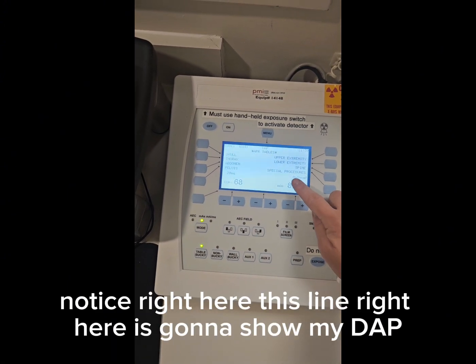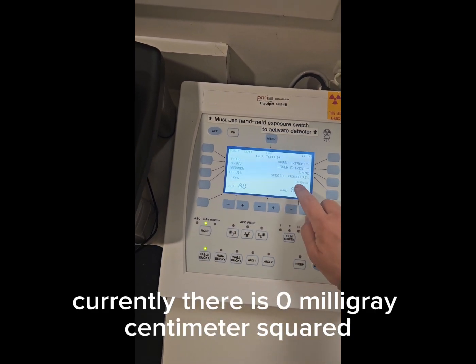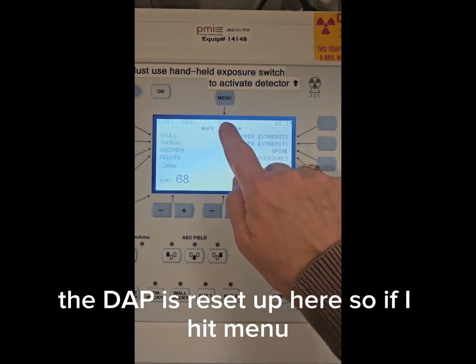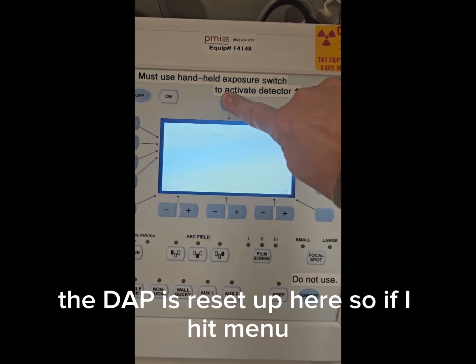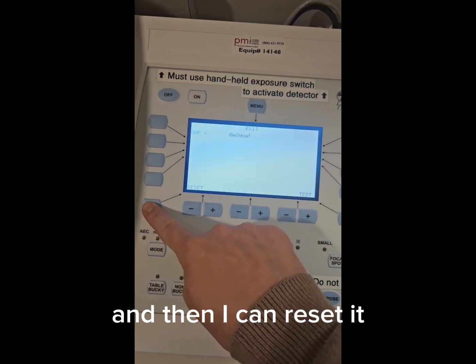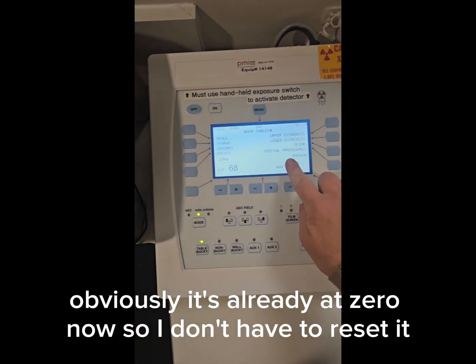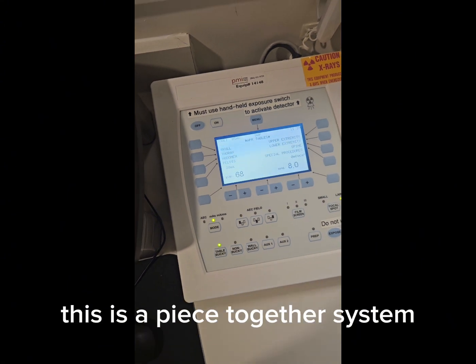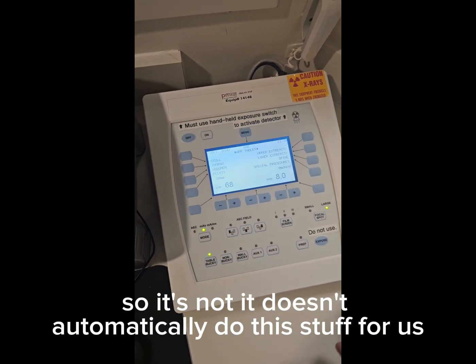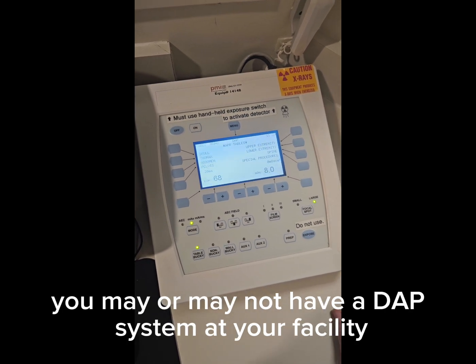Notice right here, this line right here is going to show my DAP. Currently, there is 0 milligray centimeter squared. The DAP is reset up here. So if I hit menu, I can actually go to a DAP screen, and then I can reset it and then go back to the screen that I was just on. Obviously, it's already at 0 now, so I don't have to reset it. This is a piece together system, so it doesn't automatically do this stuff for us. You may or may not have a DAP system at your facility.